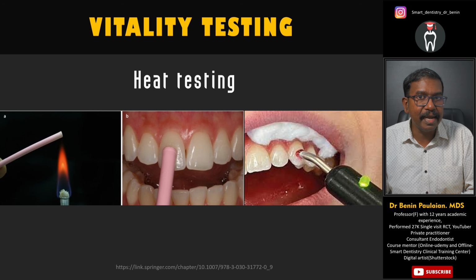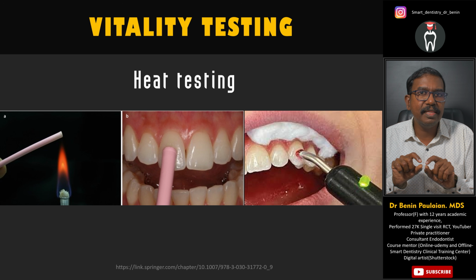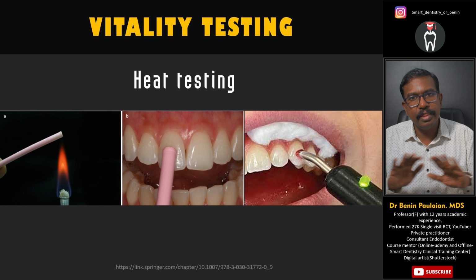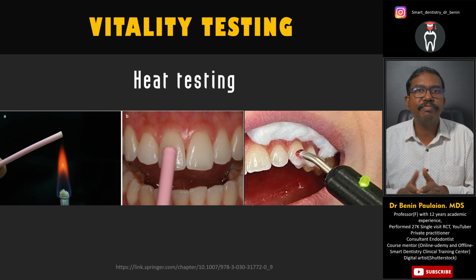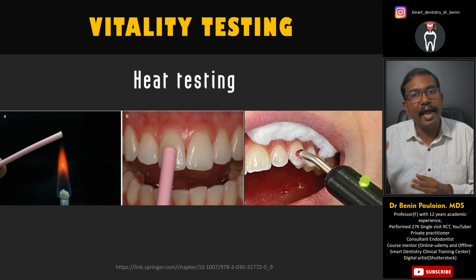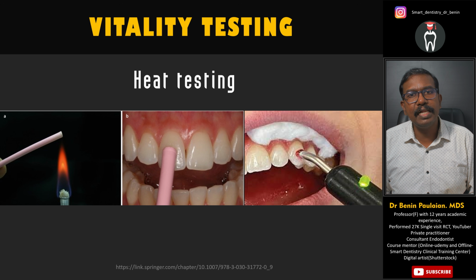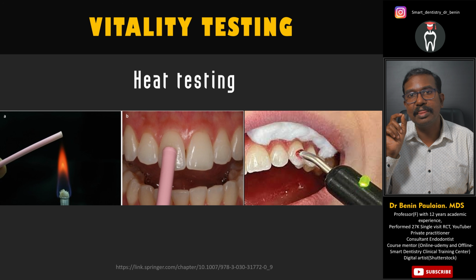Whenever there is an early response, there could be some problem in the tooth. When there is a normal response, there will be no problem, and if there is a delayed response, probably there might be a problem, but the chances are quite less, and if there is no response, then the tooth definitely has some problem.